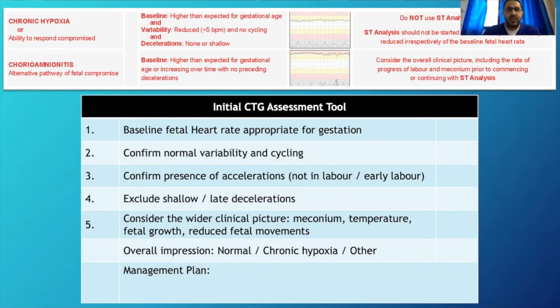There are two big baseline trials that looked at the gestational age and the heart rate over gestational age. One was a German study that covered about 80,000 babies, and another was an older English study that covered about 30,000. They give you a description and a curve that's available there. However, the best tool, because we like to personalize our care, is to look at what the baby's heart rate was in the previous assessments. That is your best indicator.